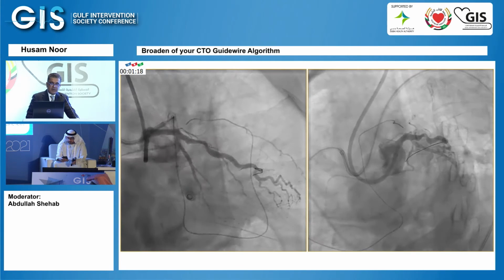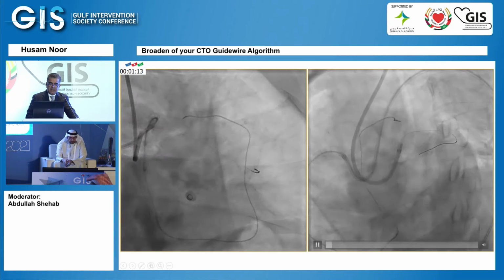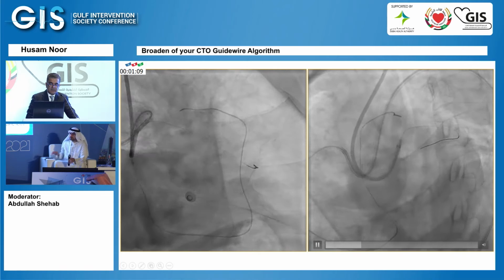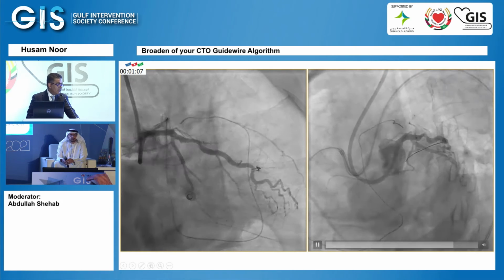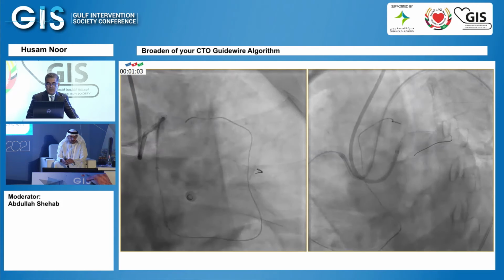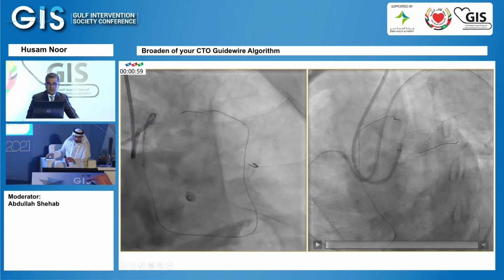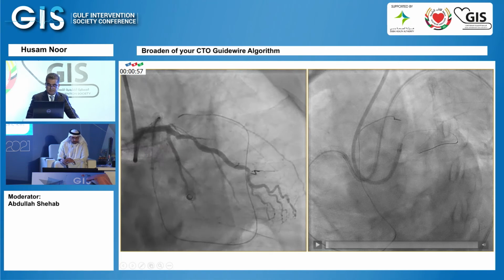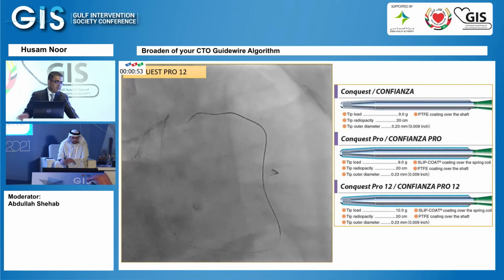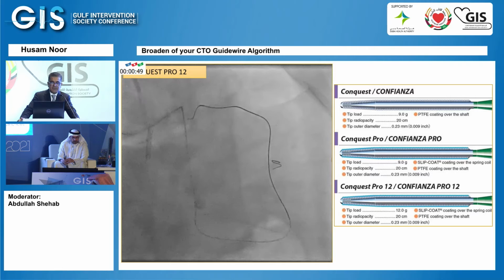So this is where we are in location. And you can see, as we discussed earlier, that now we can see the tortuosity. We are probably in the vessel architecture, but not inside the lumen. But we now need to connect from here to here. So we went back to escalate retrogradely, just to make a puncture retrogradely with the CP12.